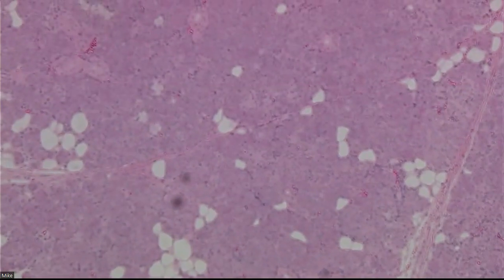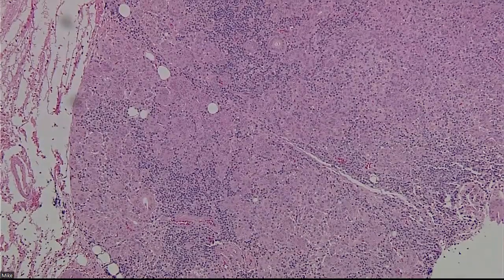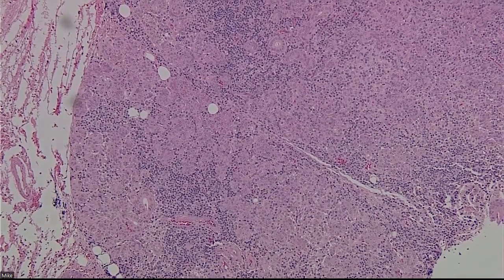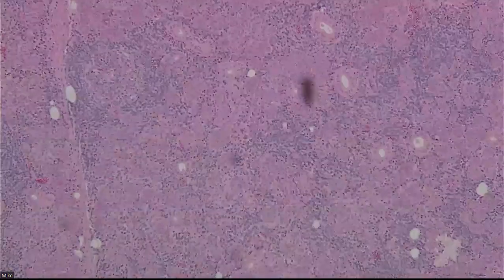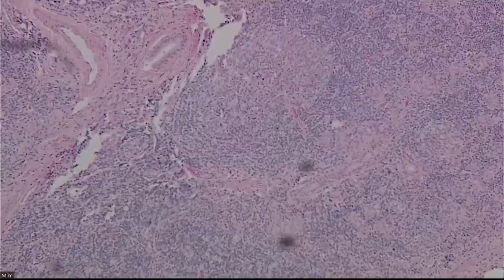So when you look in the areas of lymphoid inflammation, is the epithelium basically spared of the lymphocytes, versus if the lymphocytes start to percolate into the epithelium? That's more suggestive of a quote unquote lymphoepithelial lesion, which is more suggestive of a low grade lymphoma. So sometimes you'll even see in heme workups for salivary lymphomas where they'll do a keratin stain, not because they're worried about carcinoma, but to see how the epithelium is broken up by the lymphocytes, right?